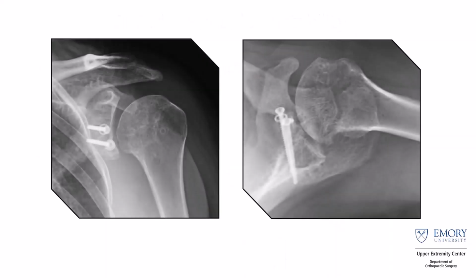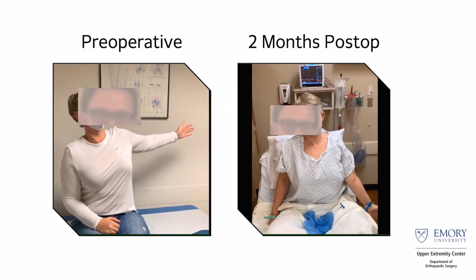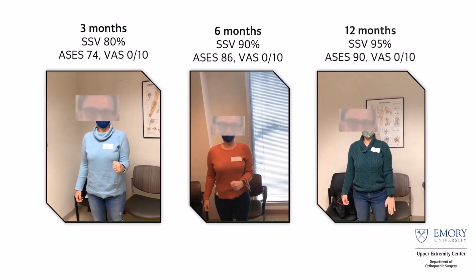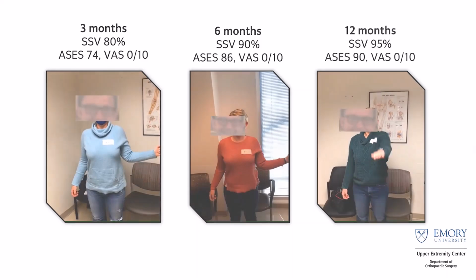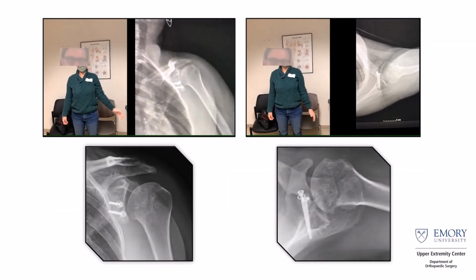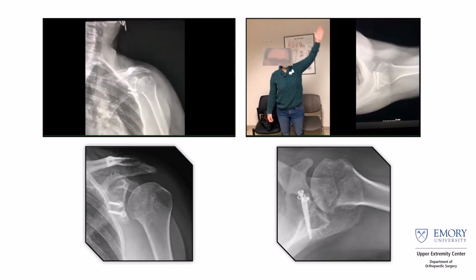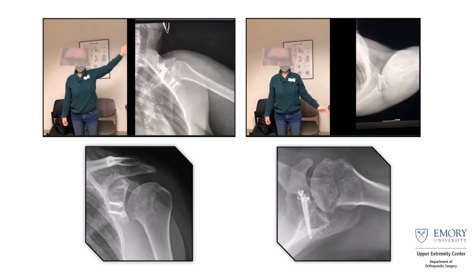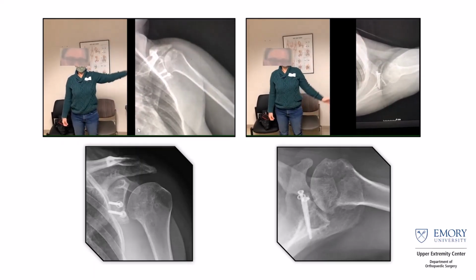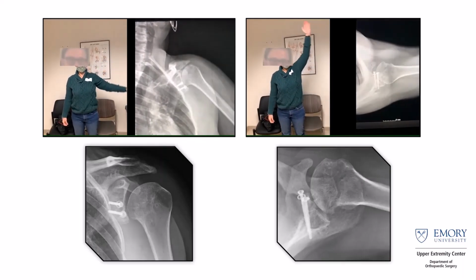You can see our post-op x-rays look pretty good. Post-operatively, she was able to get back to fairly good motion. She was able to return to her work as a collegiate volleyball ref. Basically very little limitations. The cool thing about the DDR is you can actually see what's going on, how she actually stayed inside the joint, and she's actually centered over that distal tibia allograft you can see in the upper right. On the X-ray view, it also kind of shows how, legitimately, what we did is we didn't necessarily recenter that well. What we did is we created a bigger surface area for her to now function on, a bigger platform.